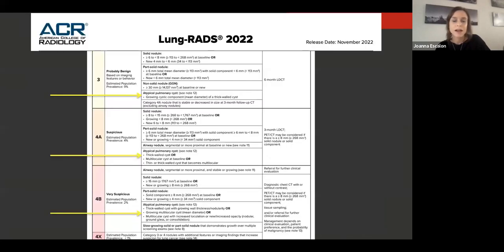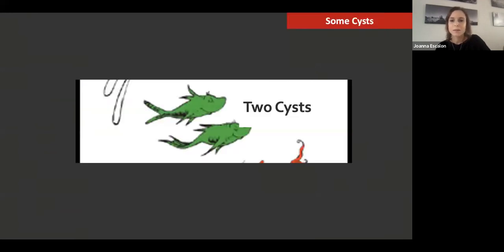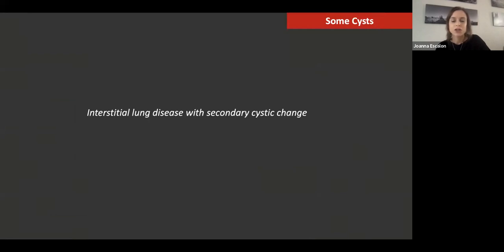So much so that we finally, just this month, got Lung-RADS 2022 released, and it even includes advice on how to follow up these atypical pulmonary cysts with mural nodularity. Going into this is kind of beyond the scope of this talk, but it just got released this month. Very exciting. So moving on to other causes of cysts.